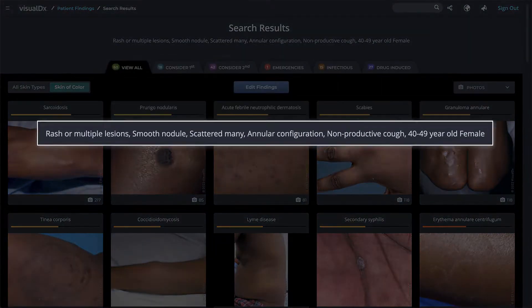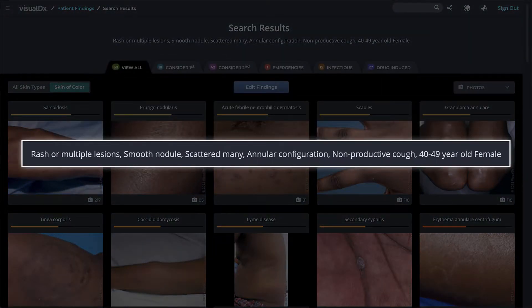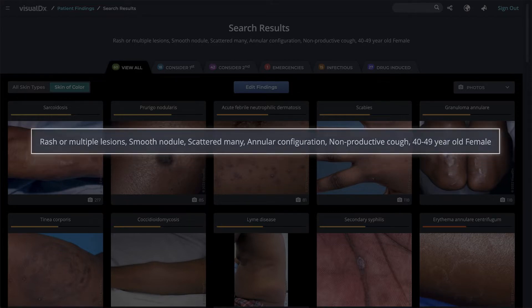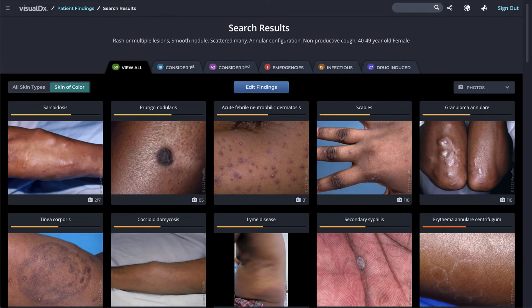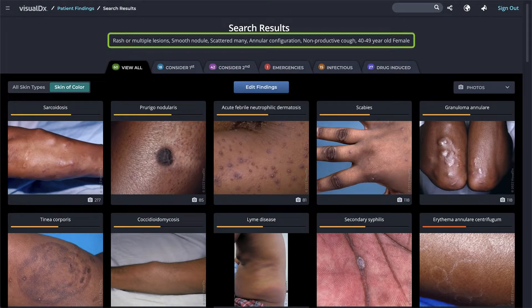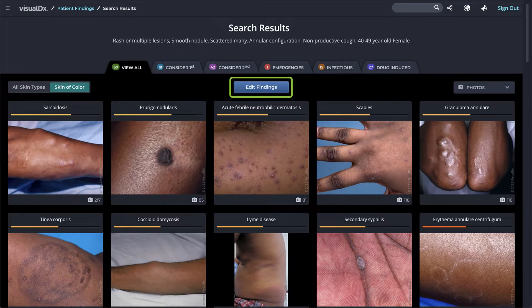We have created a workup for a patient with a rash of many scattered smooth nodules with an annular configuration and a non-productive cough. Let's look at the differential results. The findings we entered are listed at the top of the page. You can always edit findings by clicking the blue button to go back to the workup.